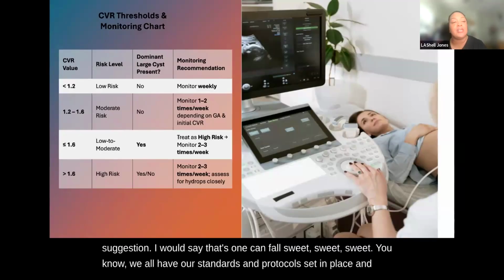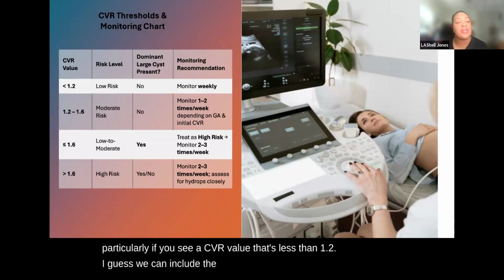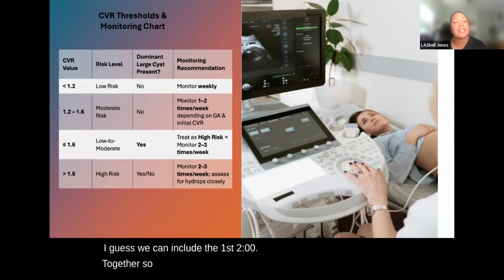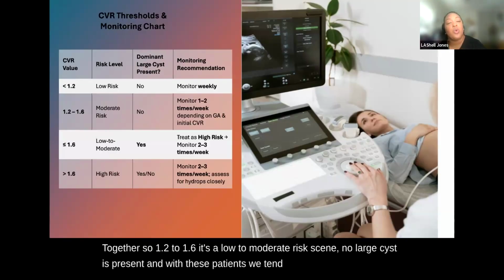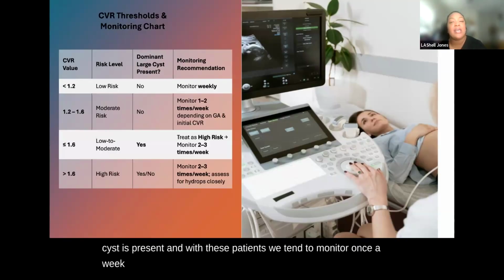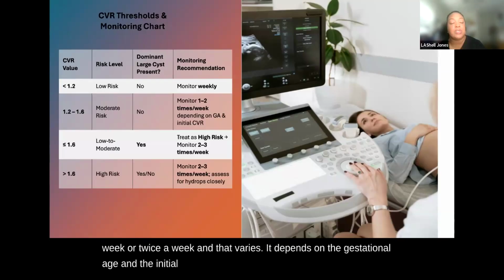So particularly, if you see a CVR value that's less than 1.2, I guess we can include the first two together, so 1.2 to 1.6, it's a low to moderate risk. No large cyst is present. And with these patients, we tend to monitor once a week or twice a week. And that varies. It depends on the gestational age and the initial CVR ratio. Okay.